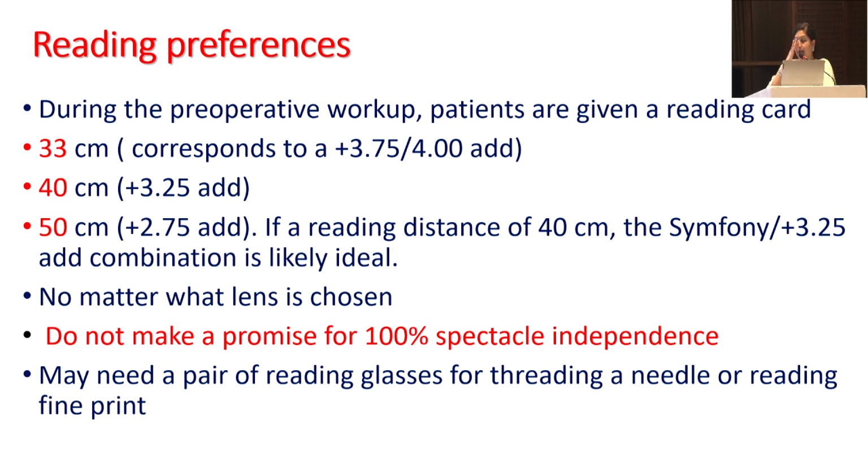What we do in our practice is, I had an interesting patient. A patient was operated elsewhere with an EDOF, and was not told that she would need a reader. So she could see 6/6 for distance. She was fairly okay for computer, but she could not read for near without glasses. Her complaint was she wanted to read without glasses. Then she came to me for the other eye, and we actually measured where she was holding it, and it was exactly 33 centimeters. So we went ahead and put a Synergy, even though the principle of the IOL was different in both eyes. Thankfully, even after completely explaining and counseling her that the two eyes are going to be different, she accepted it well, she's happy.